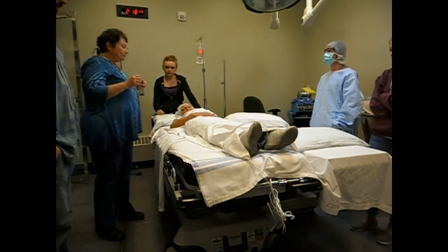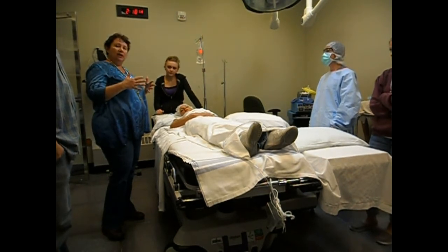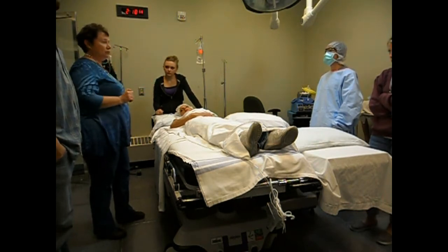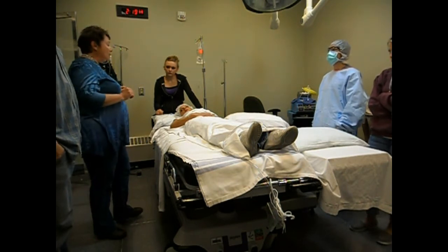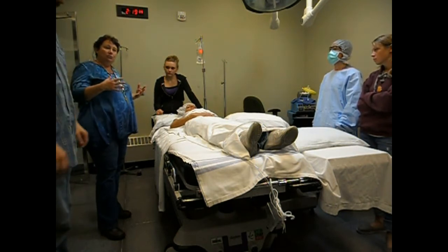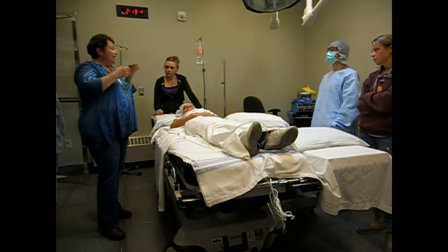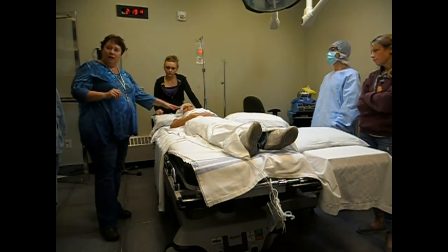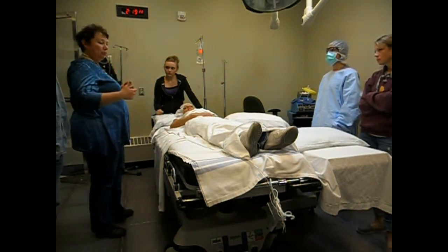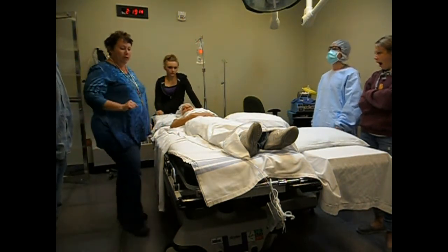Now, the one thing that we need to take into consideration is that the patient will most likely, if they're having a general anesthetic, of course, be put to sleep on the stretcher before they get moved to the operating room table. And so the big thing is that we have to worry about our patient's airway. They'll have an endotracheal tube in, and we want to let anesthesia give us the go-ahead when it's okay to move, and they'll have to disconnect the endotracheal tube, and then we would roll. So we don't want to disconnect it too soon. We want to disconnect it right before we're going to roll. And so we have this side rail down, we have that side rail down, we have both beds locked.